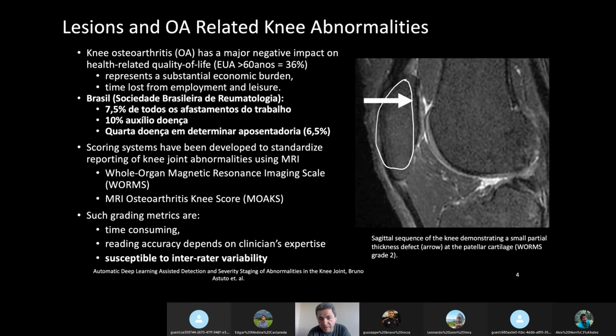This here is the femur, and this here is the tip of the tibia in your knee. This structure here is the cartilage of the patella, and this here is the cartilage of the femur, and we have a little bit of cartilage of the tibia over here.